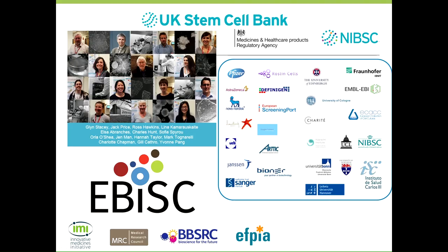Orla, were all the cell lines in a standard, consistent culture system when you started the assay? No, so this is the thing. We grew them in what they came in, but they were either in E8 vitronectin or mTeSR or Matrigel, basically. Any sense of whether or not the culture platform they were in influenced the fate decision? Yeah, we looked at that, and it didn't appear to have any effect that we could see.